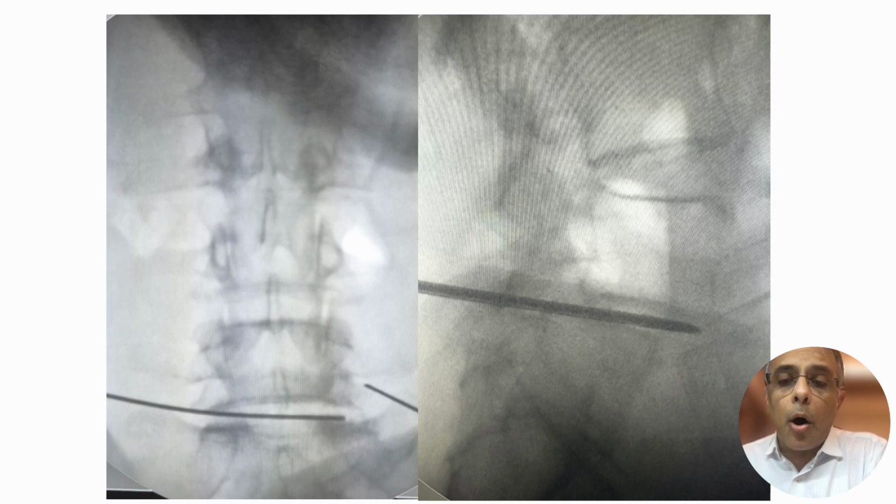So this is very important to achieve the optimal position of your cage, that in AP your guide wire should go all the way to the medial border of the pedicle or beyond that slightly, and in lateral your needle should be at the anterior margin of the annulus.